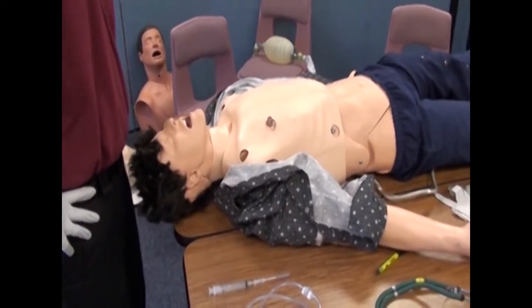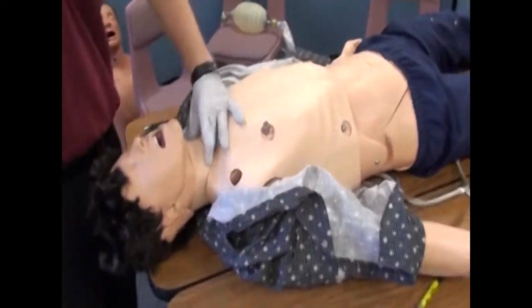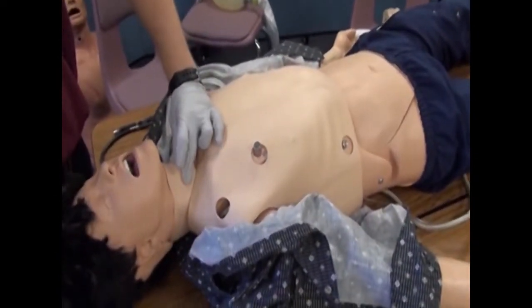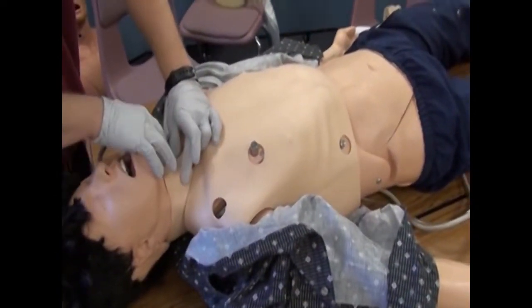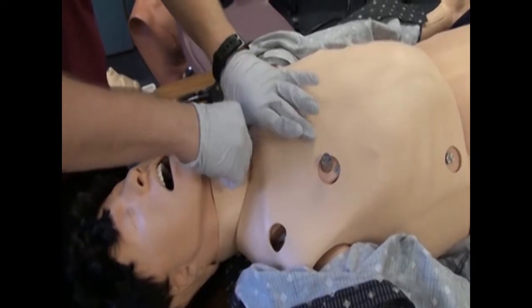Stabilizes the larynx using the thumb and middle finger of one hand. Palpates the cricothyroid membrane. Cleans the site.